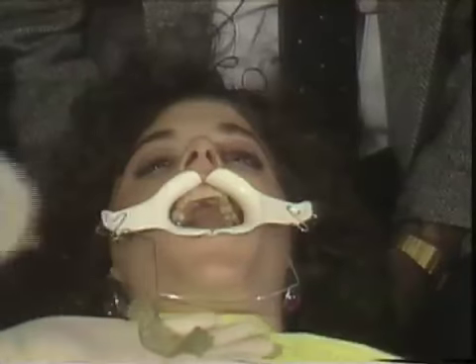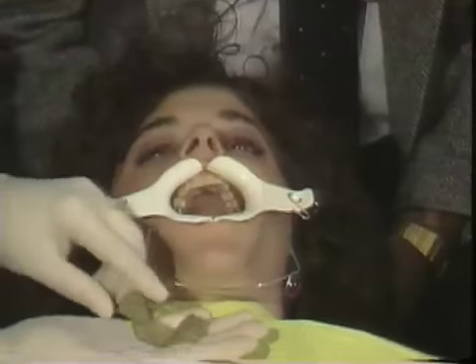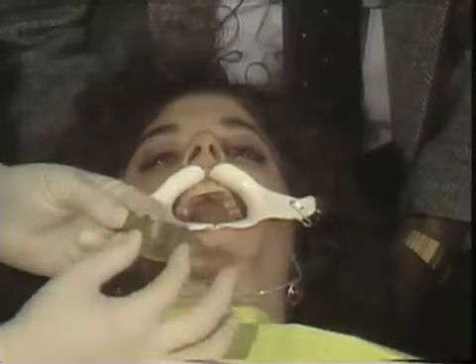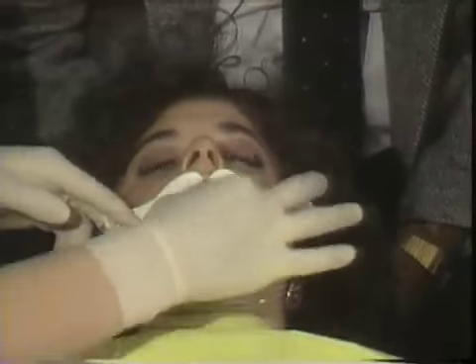We're also using a tongue away, which is a product that can be used in the posterior aspect of the mouth to quite literally keep the tongue away. And then bite firmly. And you want to keep it right there.